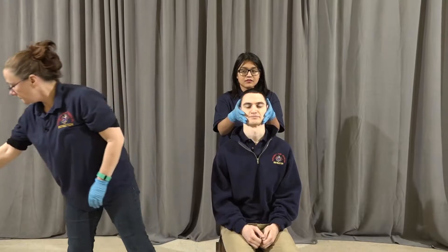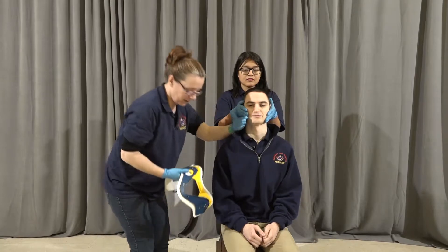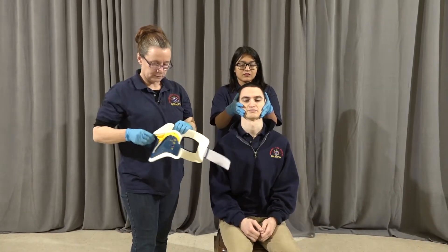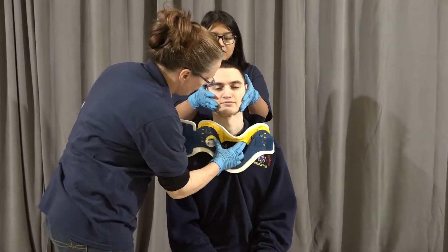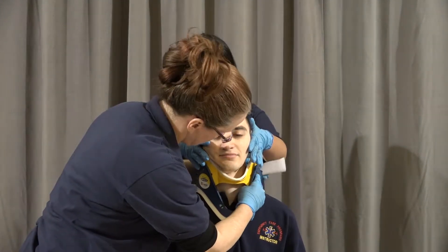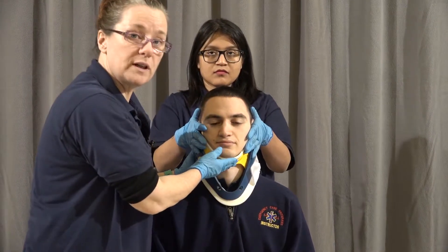I'm now going to measure and apply a collar. I'm going to match my fingers to the collar. We're going to apply it, moving in over the breastbone, centering it under the chin. Make sure it doesn't interfere with breathing.